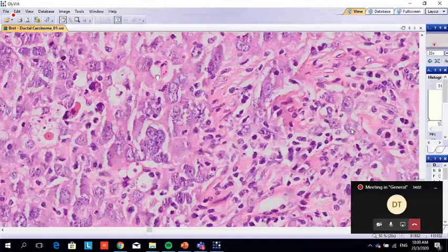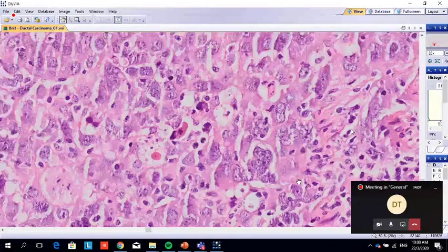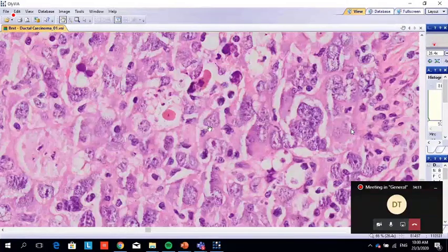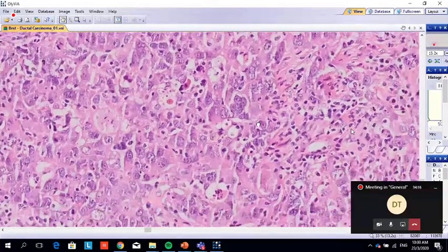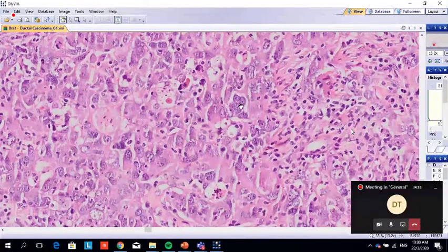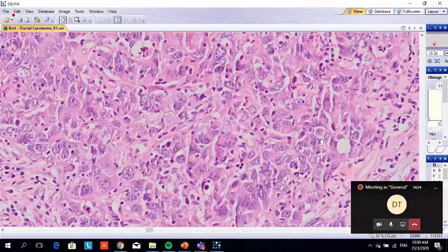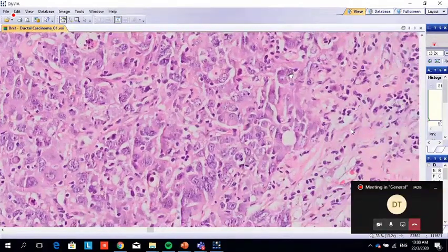This is mitosis. This one is mitosis. See, also this mitosis. This is unipolar. Okay, what else? Look at this, how the nuclei are very irregular. Okay, remember which grade this one is? How do we grade?